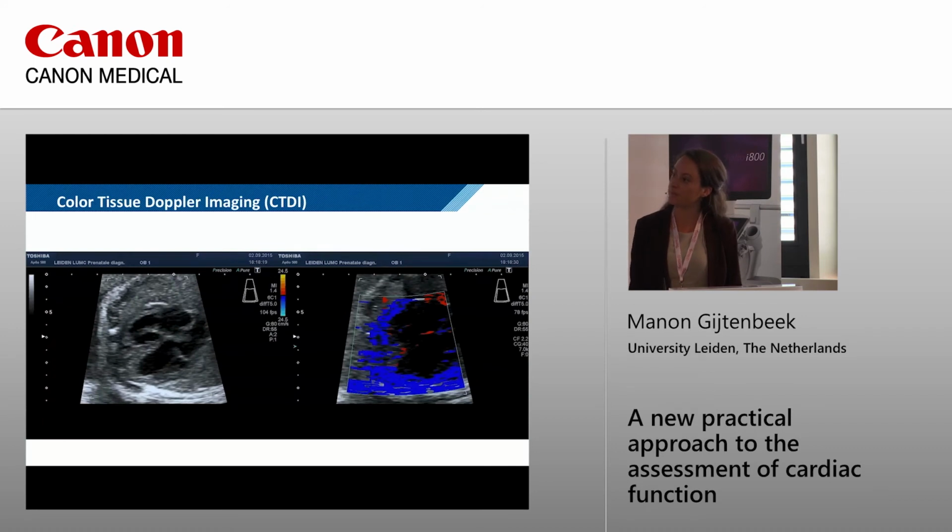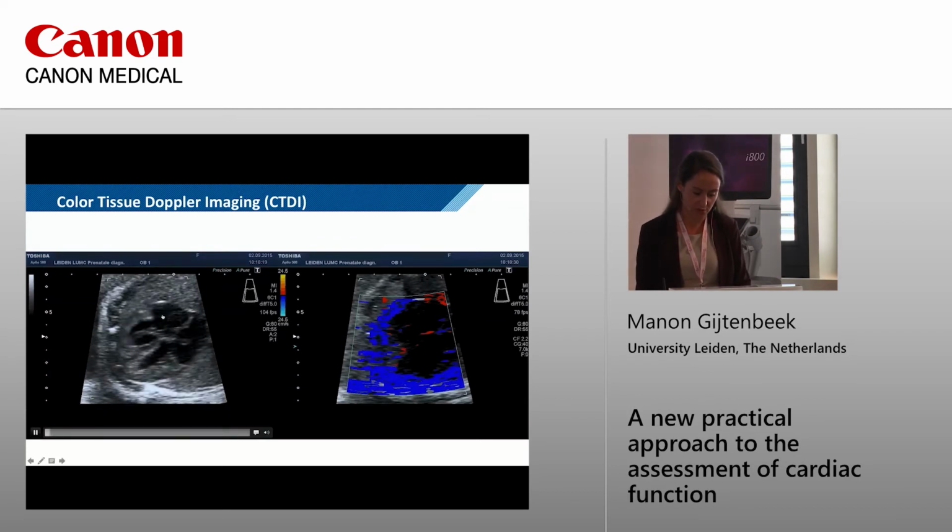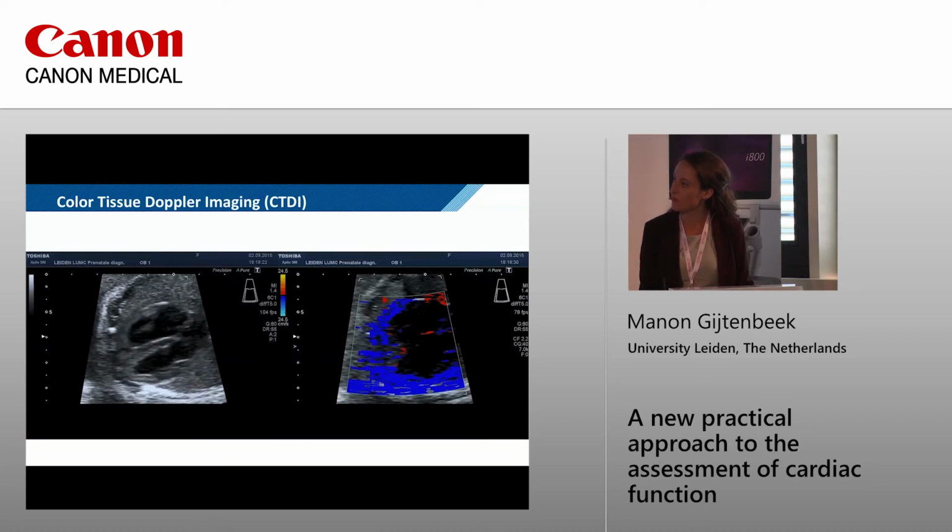Here you see an image of a fetal heart at approximately 20 weeks or so. To the left side, you see a grayscale image of the four-chamber view of the heart. And to the right, you see an image.